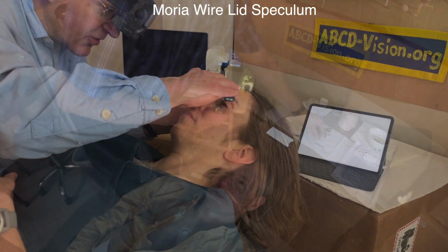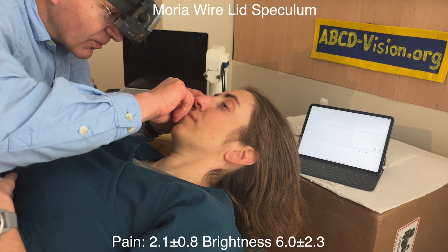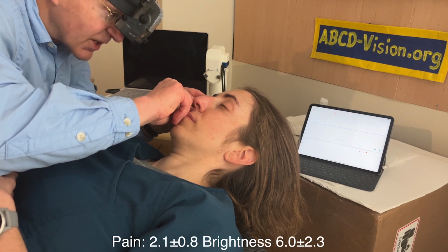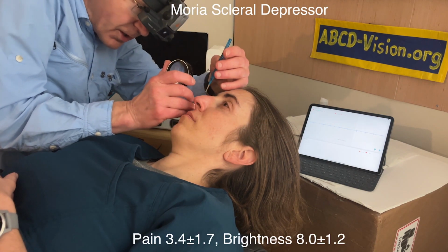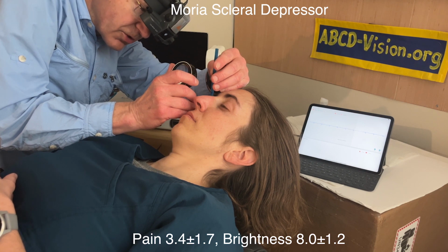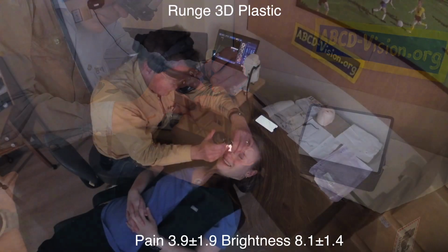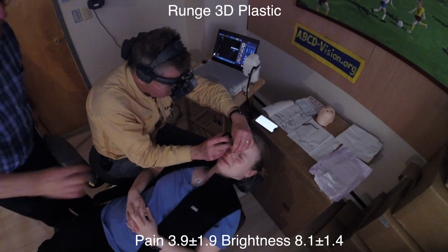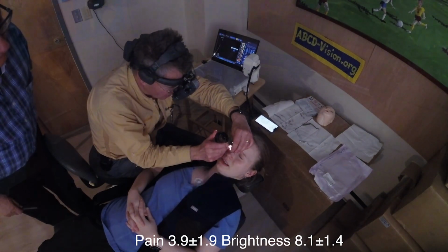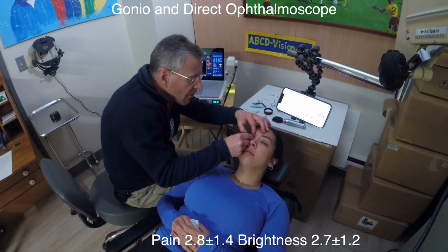That's a 7. It's my friend Bob Harrod who sort of developed these. I'm pretty sure this one was sort of responding to people's interest in staying with the Alfonso. This is the Moria scleral depressor. Look down, just a little down, and there you go, perfect. Really nice. The plastic one. But you like the handle to go out a little more at an angle that way. There's room to hold it further out. Good job.